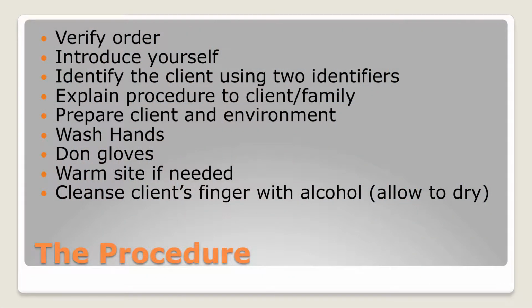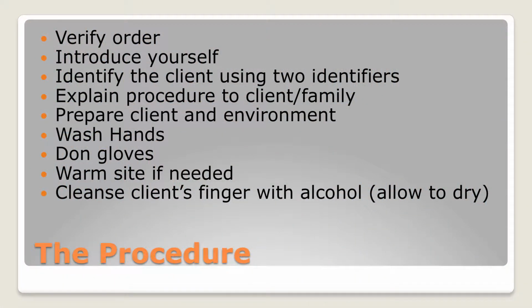Wash your hands. Get gloves on. Remember, you're about to draw blood on a patient. You do not want to be touching their blood. Standard precautions. Everybody has something infectious unless you can prove otherwise. So always wear your gloves if you know you're going to be drawing blood. Warm it up. Check their hand, make sure that it's warm. Even though you just had the patient wash their hands, you're still going to cleanse it with alcohol, because you want to make sure that the bacteria is off and allow it to dry, because if you take that lancet through the alcohol and it's not dry, it'll burn. It'll hurt them a little bit. We don't want to do that.